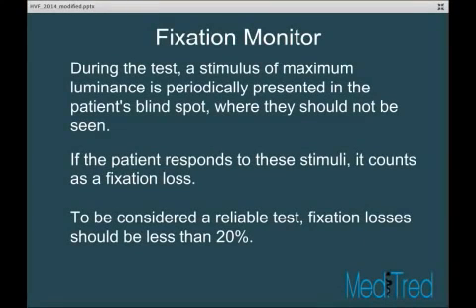There are a number of reliability indices present during the testing period. During the test, a stimulus of maximum luminance is periodically presented in the patient's blind spot, where they should not be seen. If a patient responds to the stimulus, it is counted as a fixation loss.